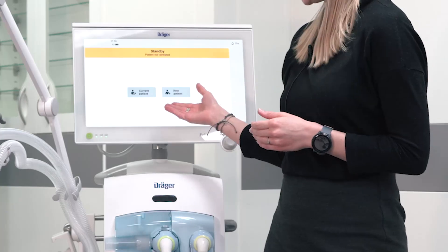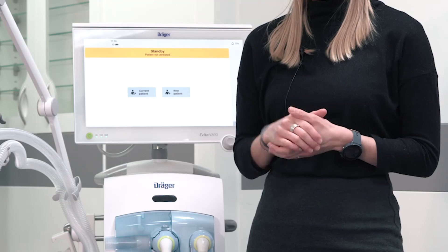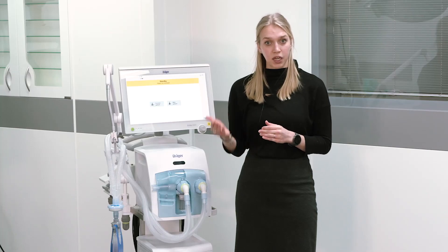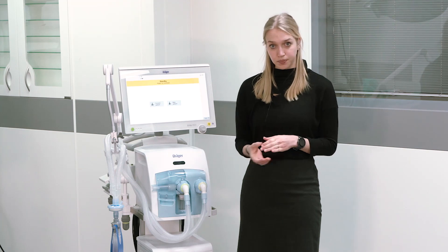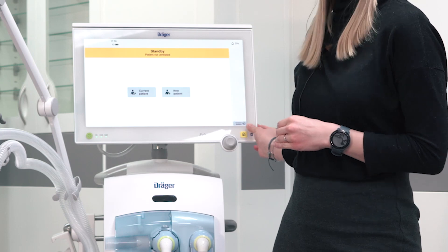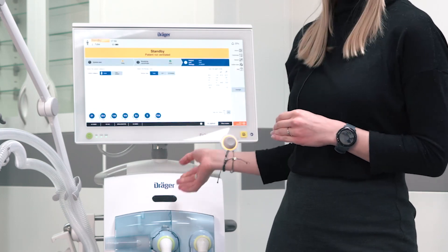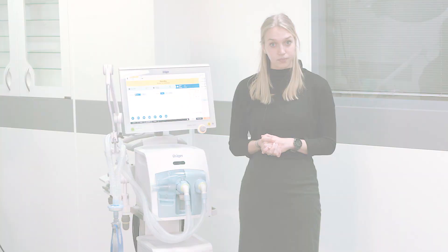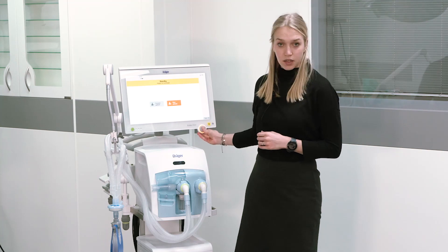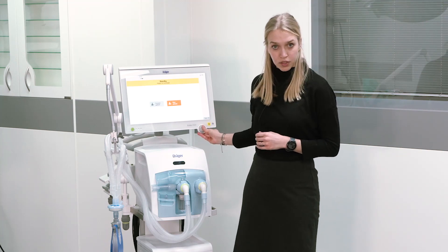If you choose new patient, the ventilation therapy will start with pre-configured settings. If you select current patient, the ventilation will resume with the ventilation settings that have been active prior to shutdown. In an emergency, you can already start quick start ventilation by selecting and confirming the rotary knob. In this scenario we will now start with a new patient — select the respective field and confirm by pressing the rotary knob.